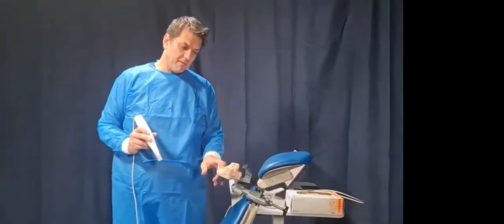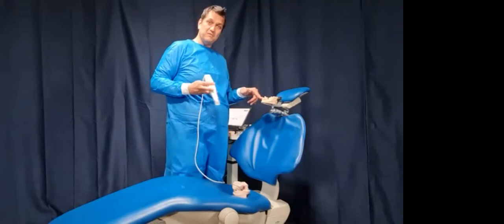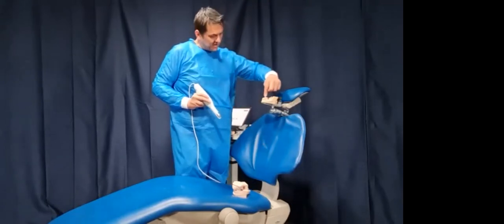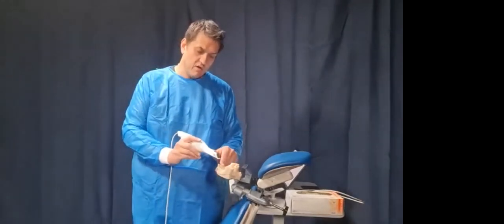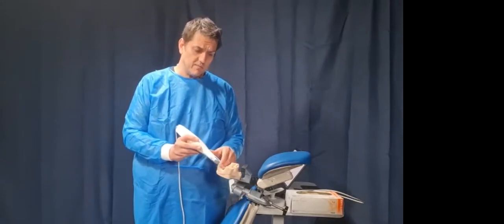So again, I had my index finger sitting onto quadrant 4. My thumb was a supporting feature that again supported my scanner head. And I went straight for that canine. I had my sights set on it. That was my target. And I just wanted to run around that as quick as I can, get a 360 of it, and then work from there. So again, I popped my index finger on, had my thumb, ran around the canine, and then I start to think, okay, geez, where do I go now? Well, I then retracted the cheek, pretty much like this, retracted it out. Might get the cameraman in again just so you can see a little bit closer. So I ran around 360. I then retracted the cheek. You can see my movement here with my scanner moving the cheek out of the way, and then I rolled, and then I was able to go.